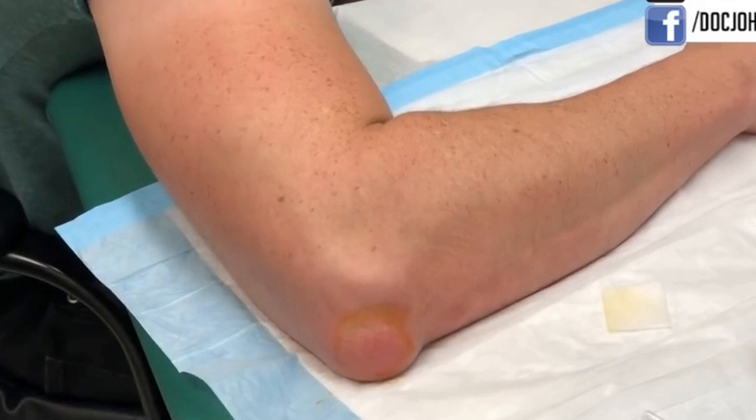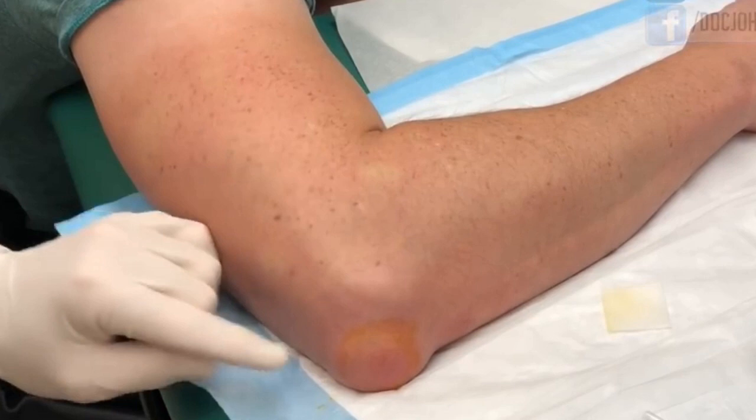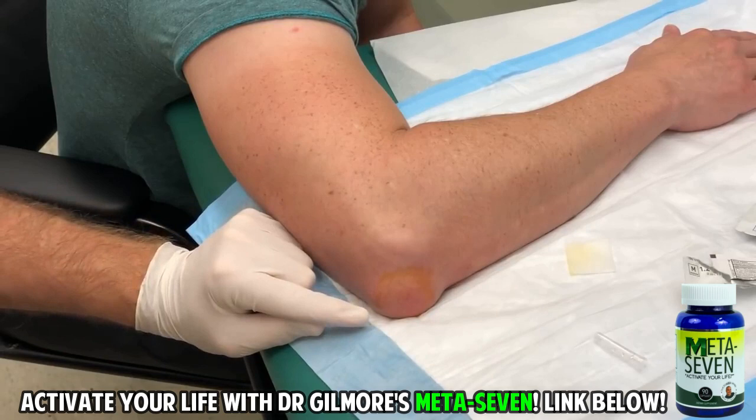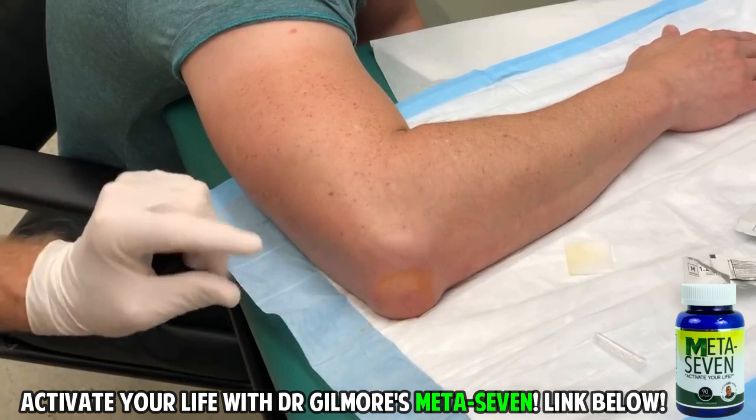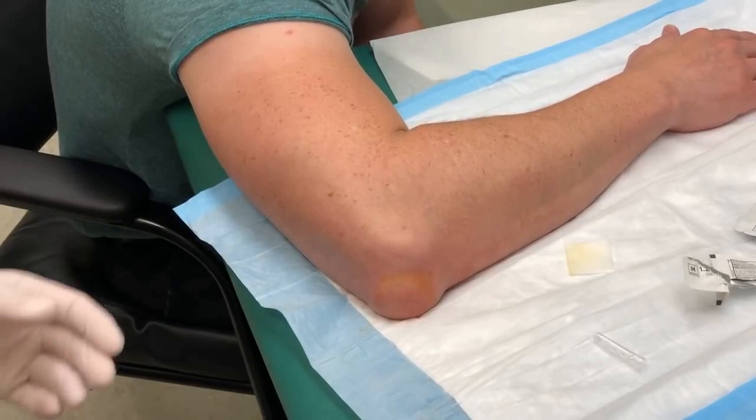With your permission, we're going to video your procedure. We're going to inject a little bit of numbing medicine — you'll feel a little bee sting. The nurse will spray some cold spray on that first, and this is the tiniest needle we have. We'll numb up a little area, then put a slightly larger needle in there and aspirate the fluid out. If it looks unusual we'll send it off for culture, but I suspect this is just a serous effusion from olecranon bursitis. Then we'll squirt a little cortisone in and wrap it.